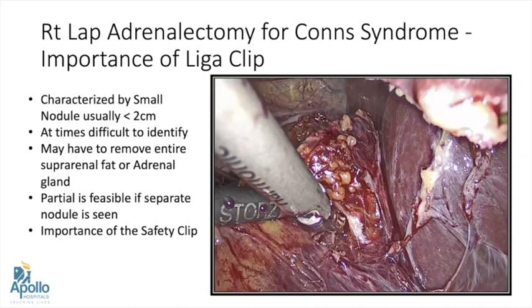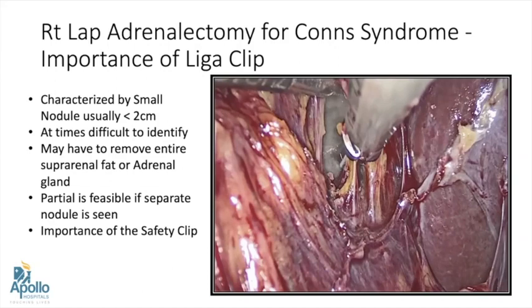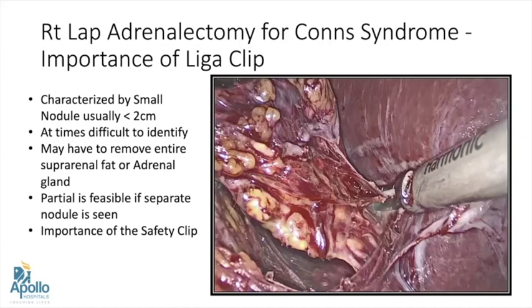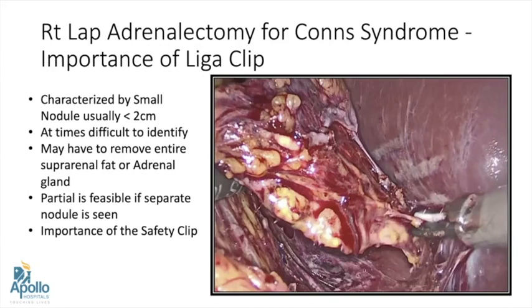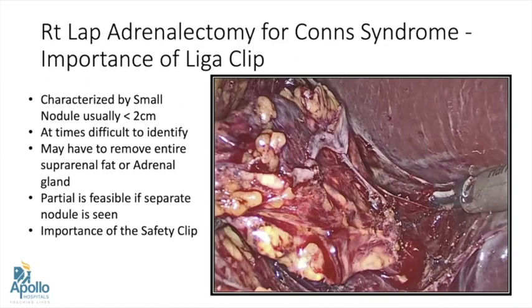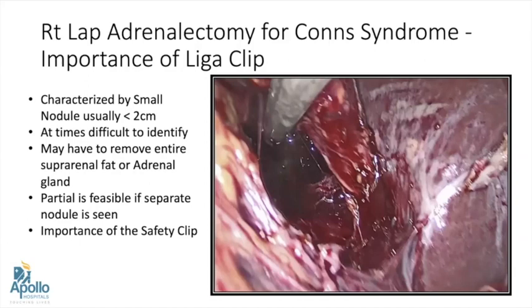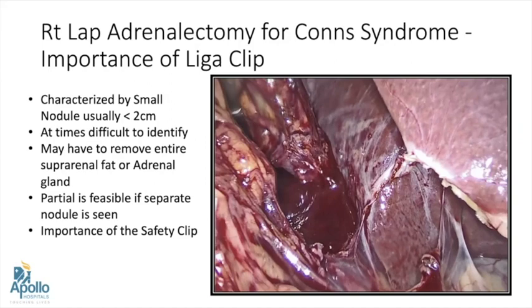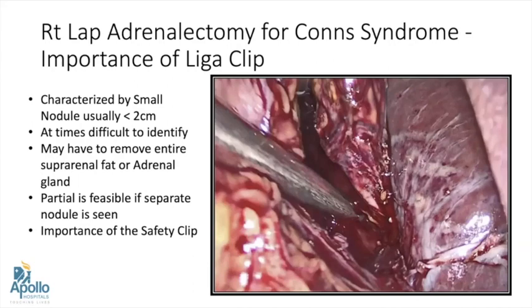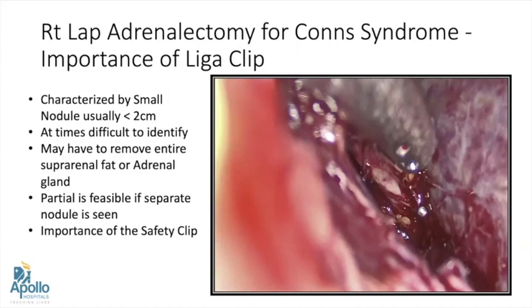Remember — removing a small adrenal or a normal-sized adrenal is much more difficult than removing a large five to six centimeter adrenal. This case I am showing because there was an injury to the adrenal vein and I wanted to show the importance of safety clips. Here we can see that because of some error during surgery — harmonic getting touched onto the adrenal vein — there was torrential bleeding. In those cases we can easily apply a metal clip blindly and this usually stops bleeding in most cases. Once bleeding is controlled, the rest of the surgery is straightforward and can be done very easily. This case is basically to show you the importance of safety clips.